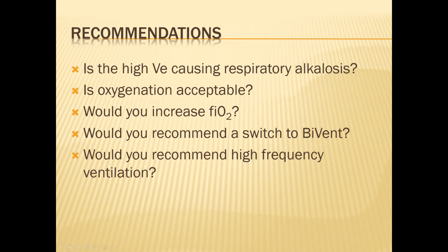Probably to prevent atelectasis. If the person's got stiff lungs as they're breathing spontaneously, I guess they don't keep their alveoli open well enough. You're right. Well, if ECMO is doing such a good job and the pH is normal, CO2 is normal, why would they want to breathe? Yeah, good point.